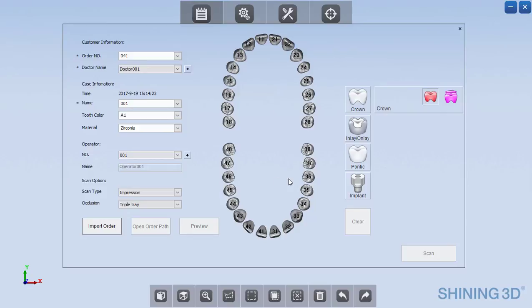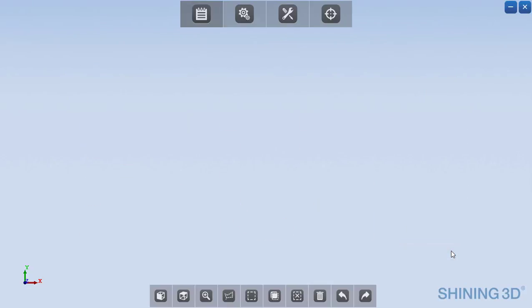So we can go ahead and select the tooth number, which in this case is number 36, crown, and go ahead and scan.